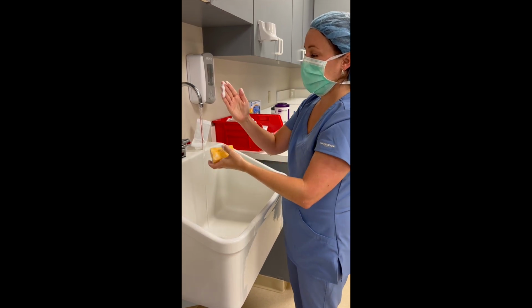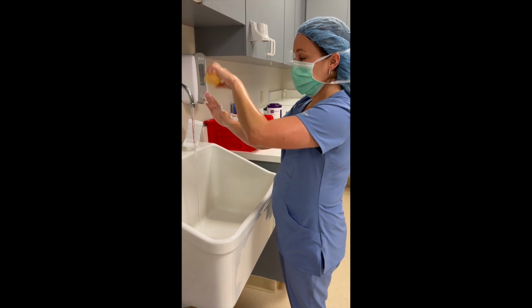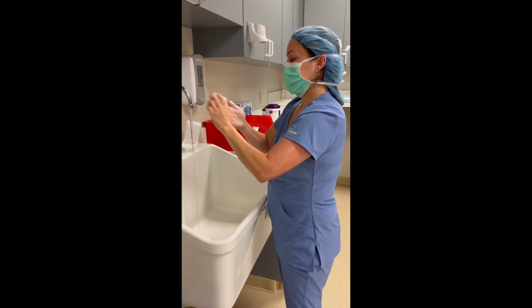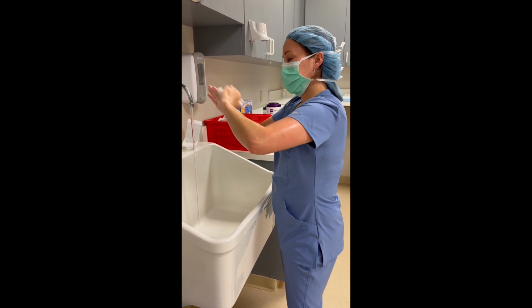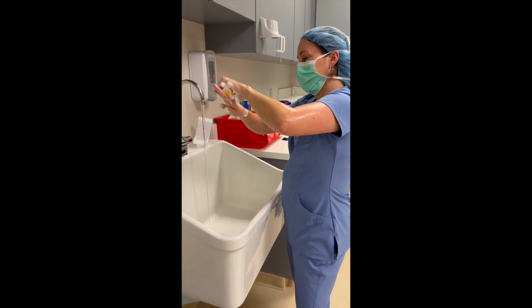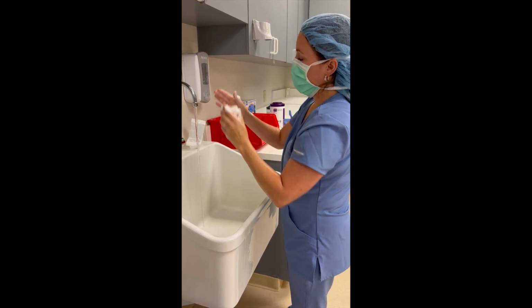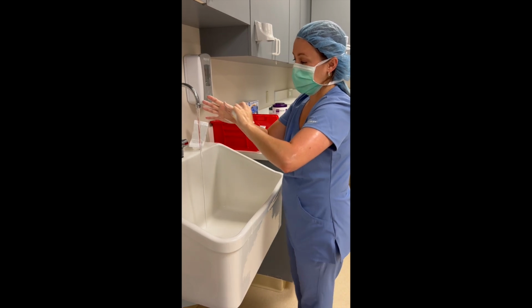Now I'm going to flatten my hand out. I'm going to treat it like it's a square as well. One side, two side, three side, four side. Same thing, 10 and 10. Now I'm going to do each individual finger. Same thing. Treat it like it's got four sides. I'm going to speed up on this one.